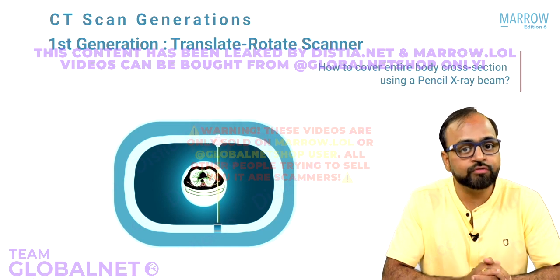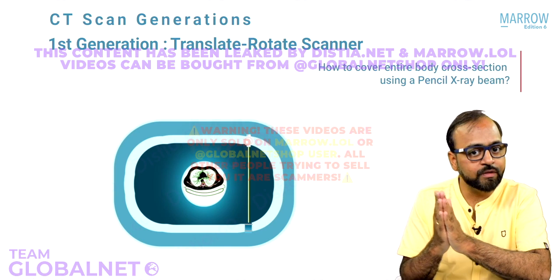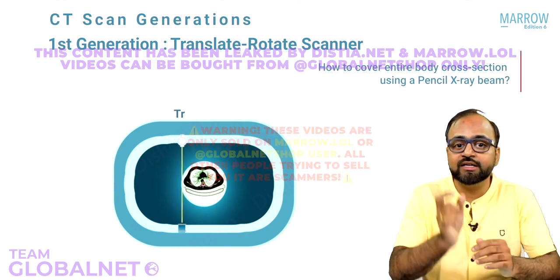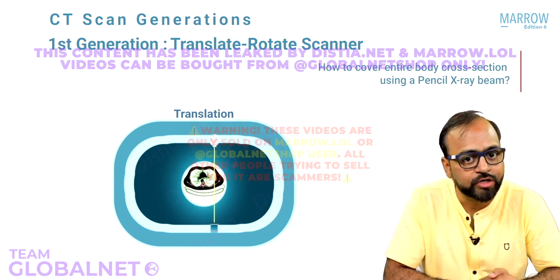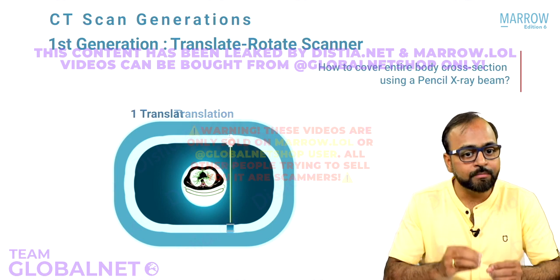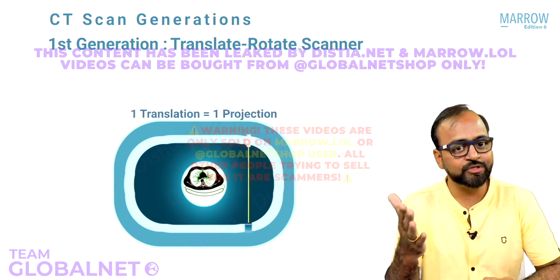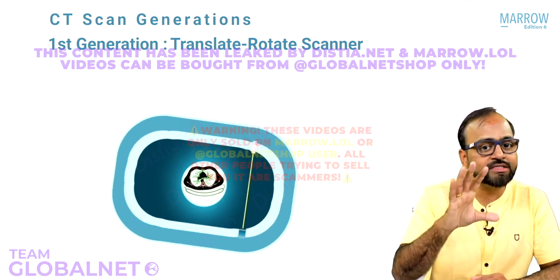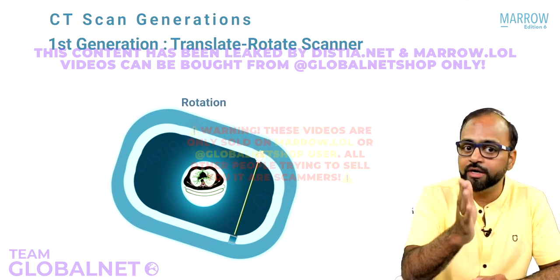Can you see that? So when you completely move the X-ray beam from one side of the patient's body to the other, this horizontal movement is called as translation. One translation completely across the patient's body is going to give you one projection. How many projections do we want? N number of projections. So what is done? After one translation is completed, the entire setup is rotated by a small angle, that is rotation. Again, you are at a new position.